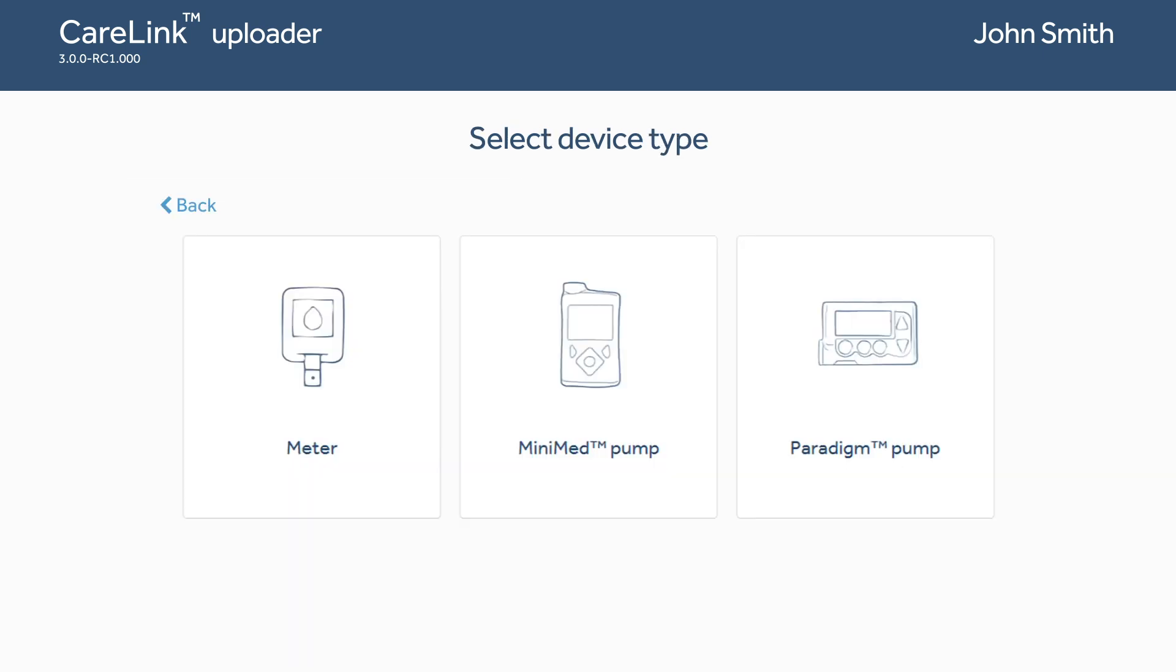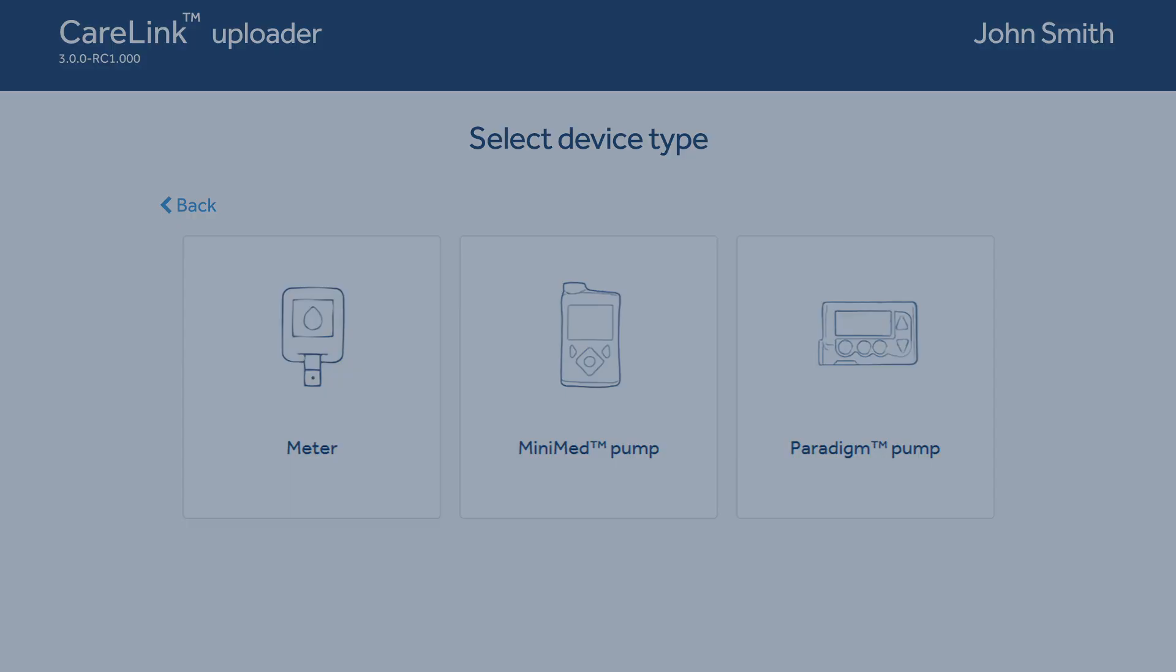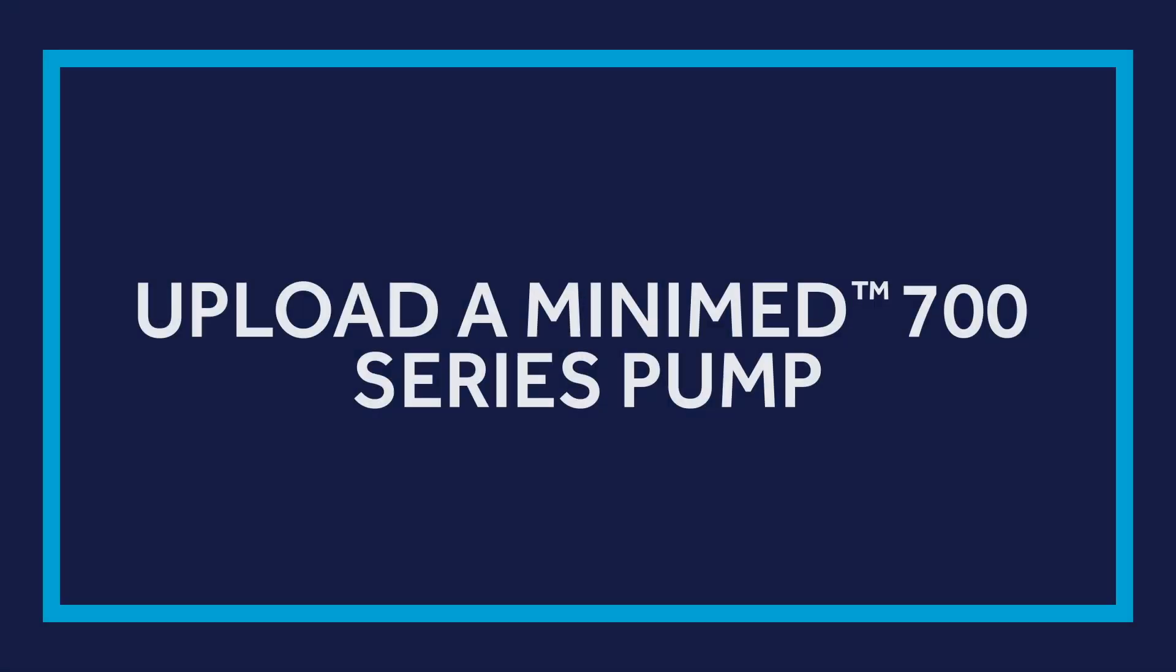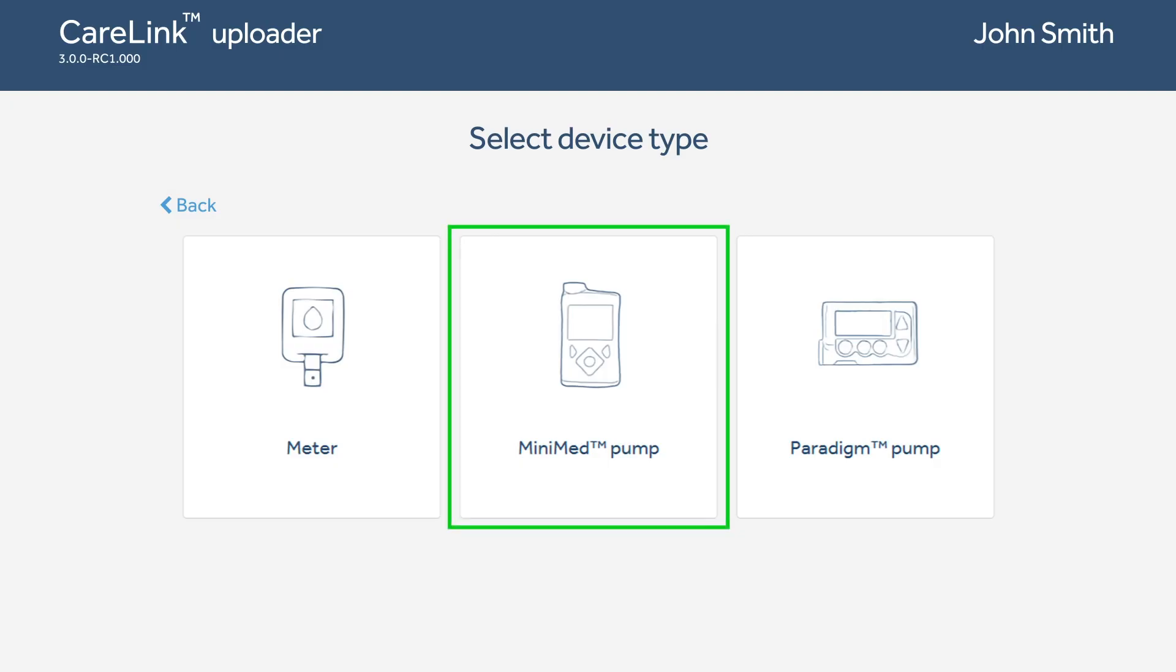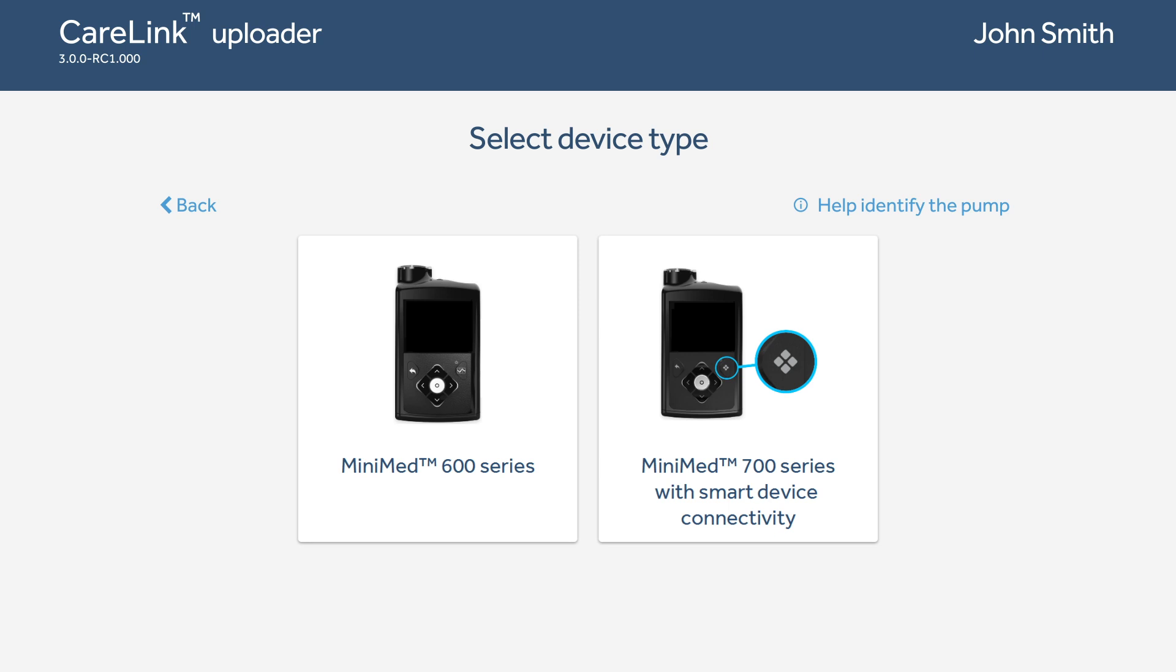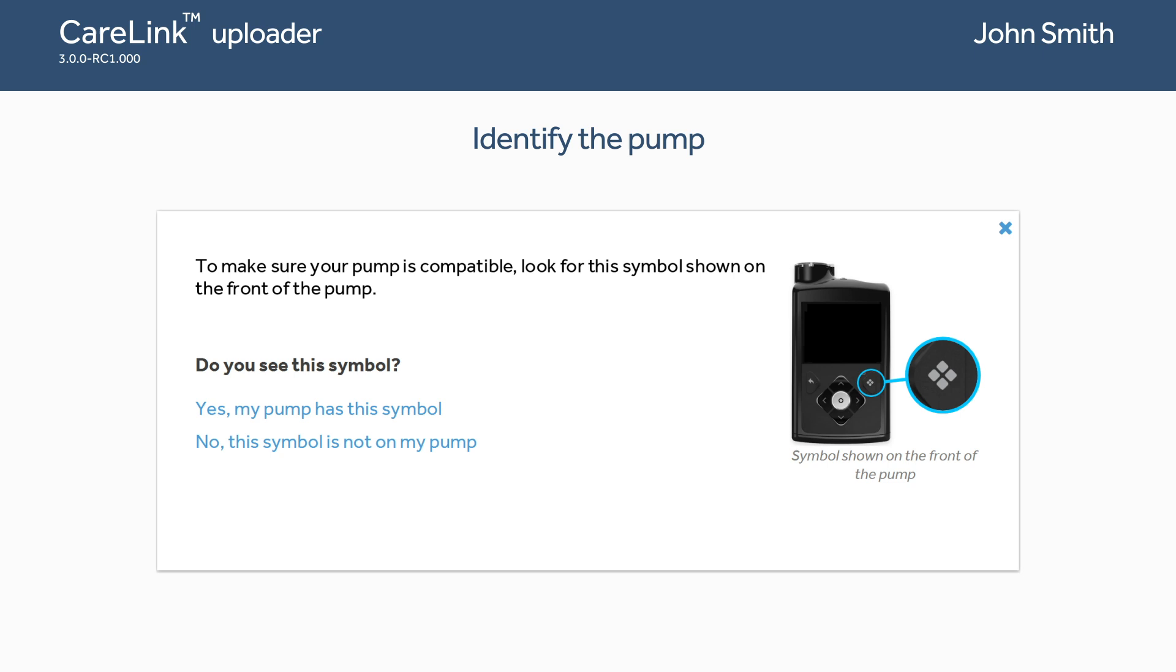Choose your device. Choose MiniMed Pump to begin the upload. Verify the model pump that you have by choosing Help Identify the Pump. Confirm you see the symbol on the front of your pump by clicking Yes, my pump has this symbol.